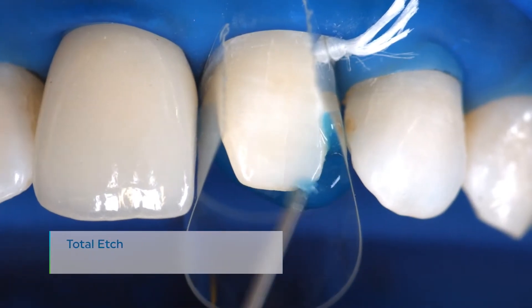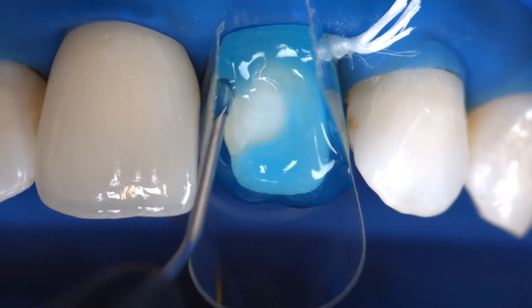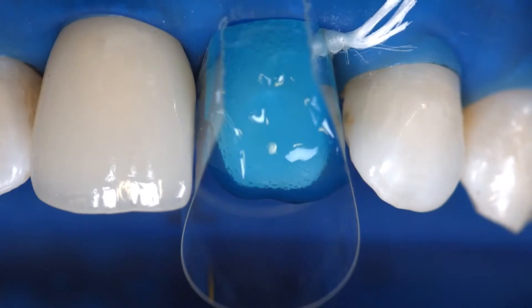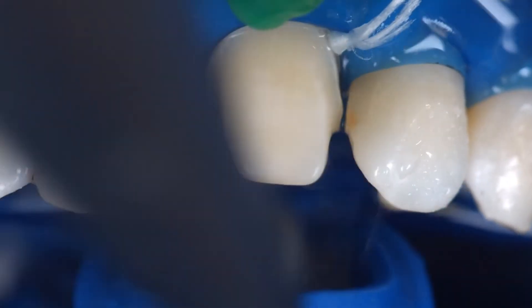Apply phosphoric acid gel, for example Total Etch, to the enamel and allow it to react for 15 to 30 seconds. Thoroughly rinse off the gel with a vigorous stream of water and air dry the preparation until the enamel surfaces appear chalky white.